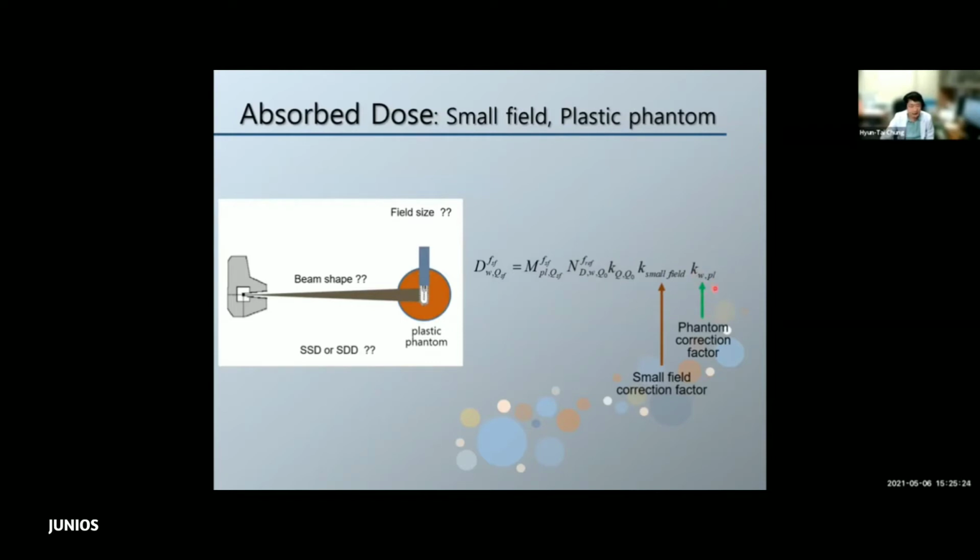So we have three conversion and correction factors now, and because it is too complicated, they combine these factors into one, and they use the same notation. So please don't be confused. So this is the MSR correction factor for Gamma Knife, which was given in TRS 483 and in many other papers.